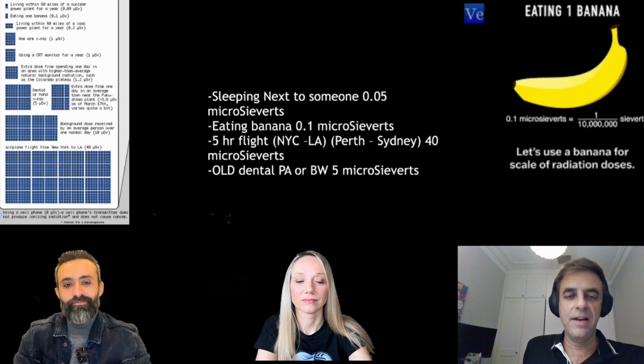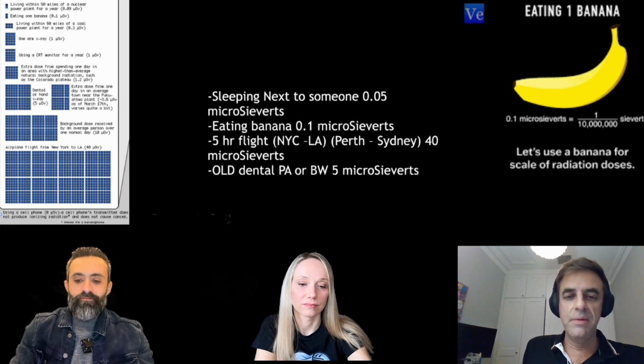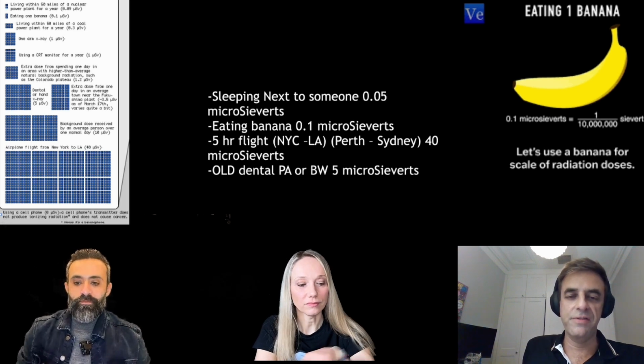So if you have that kind of radiation dose from a flight, that gives you some kind of relationship to what we're actually doing for our imaging in dentistry, because now we can start understanding that the level of radiation from a flight is relatively high if we think in regards to what we're going to get out of our own imaging, when you look at the fact that a radiograph is only 5 microsieverts. So really when a patient gets a dental radiograph, it's very, very small.